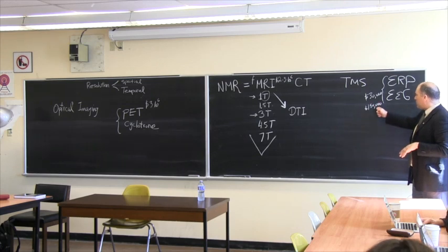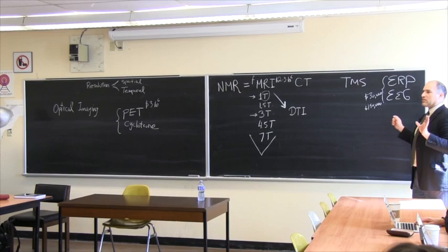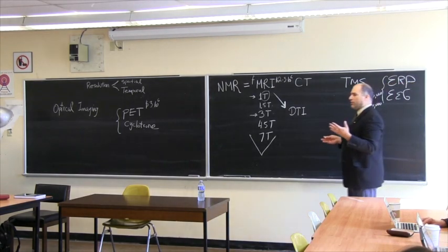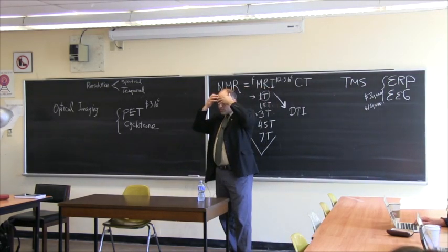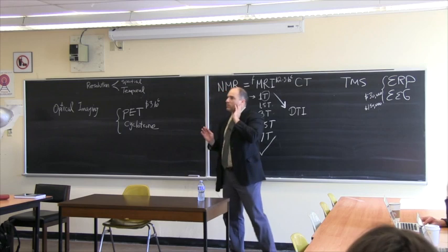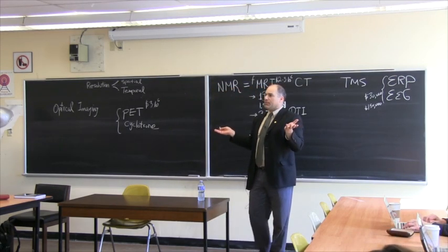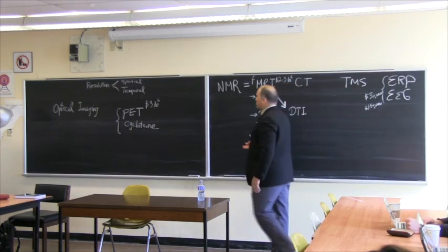But the important thing is that it doesn't matter how deluxe it is, the technique is the same. The only thing that it gives you is better coverage. For example, you have 128 electrodes instead of 6. So your head is full of electrodes. And you say, wow, full of it, but it's the same technique. It's exactly the same. If you have 6 electrodes or 128 electrodes, it just gives you better resolution.